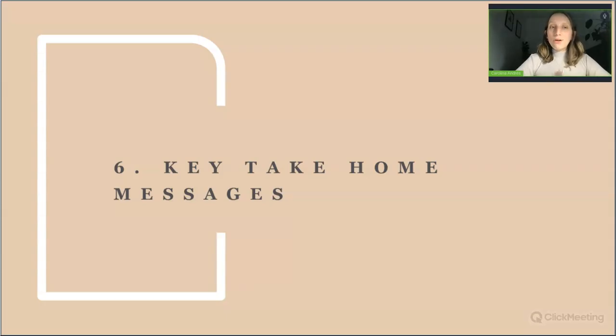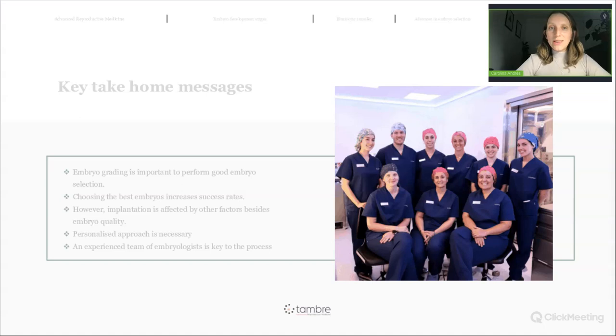So after all this presentation, the most important points I would like you to take home are that embryo grading is important to perform a good embryo selection. This good embryo selection will allow us to increase the success rates. But of course, as I have said, implantation is affected by many factors, not only the embryo, that have to be taken in mind.